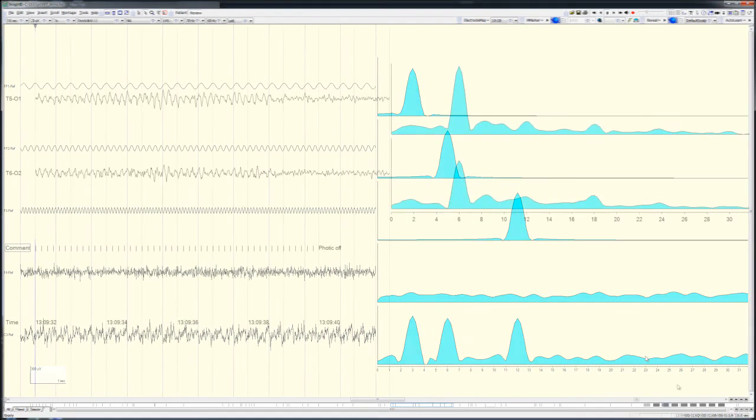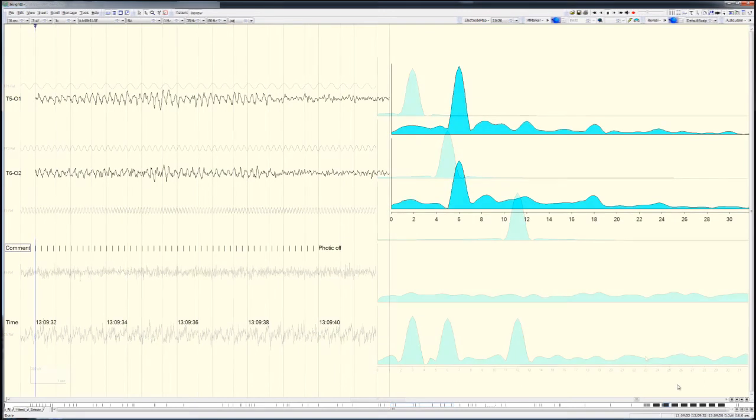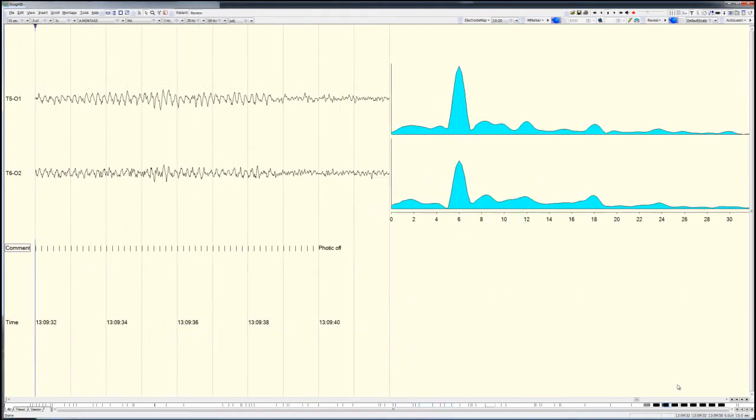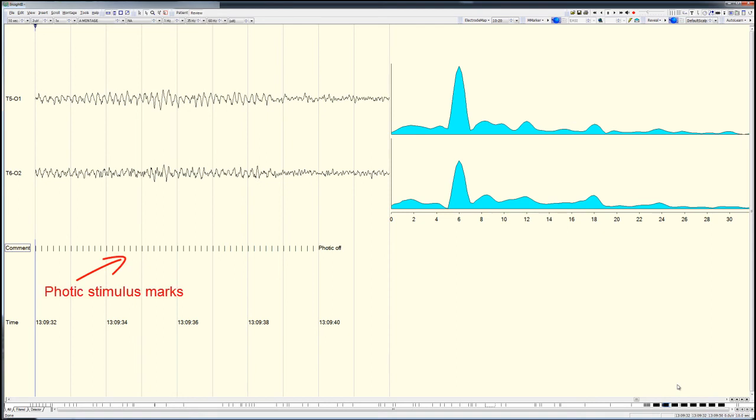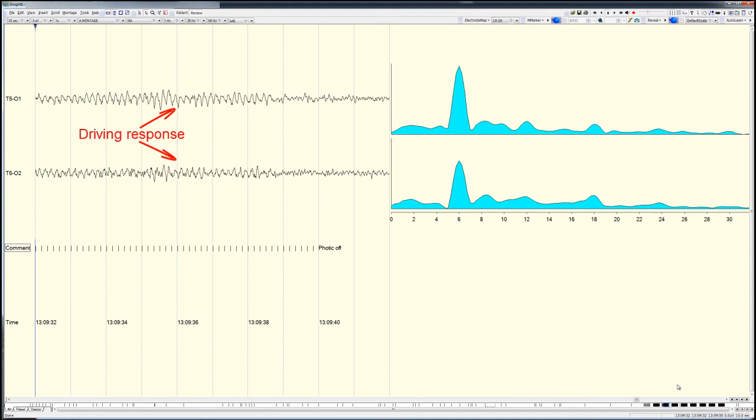This is just what happens with the EEG signals. Here I am showing two EEG traces recorded from the left and right occipital regions of a person undergoing intermittent photic stimulation. A 6 Hz photic stimulus is turned on at the start of this EEG page, and a well-developed 6 Hz driving response follows.